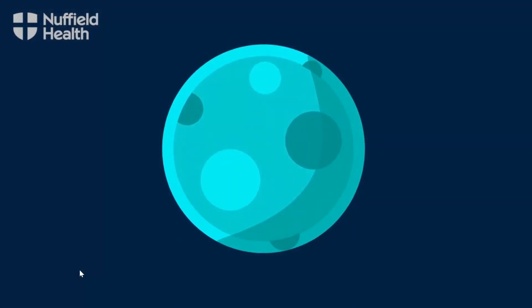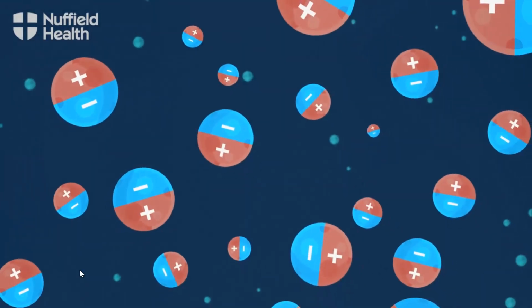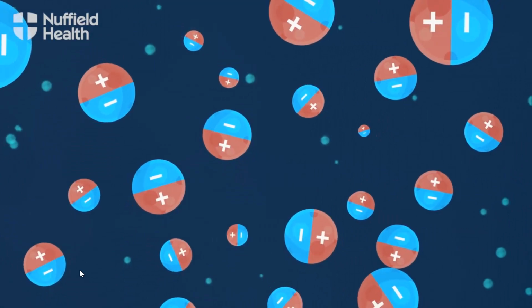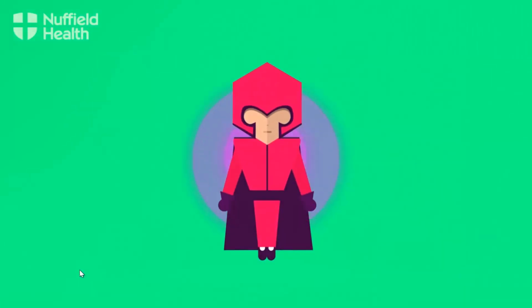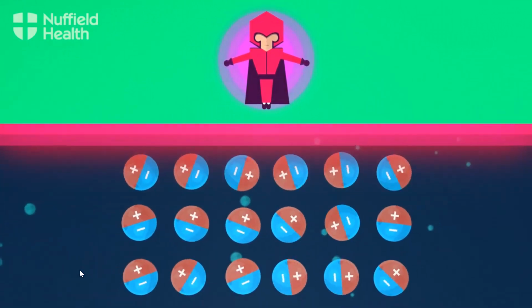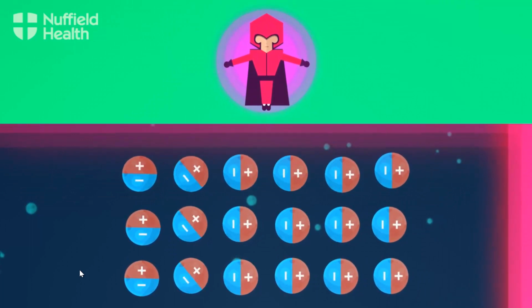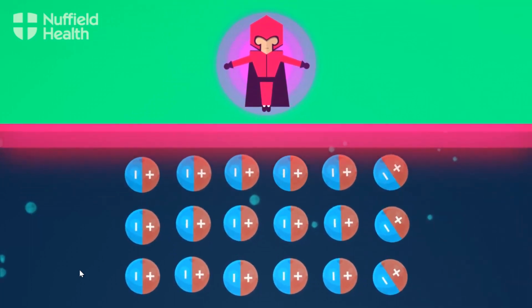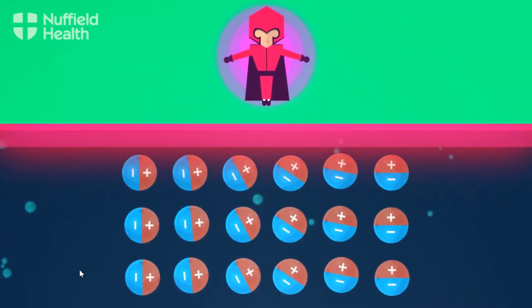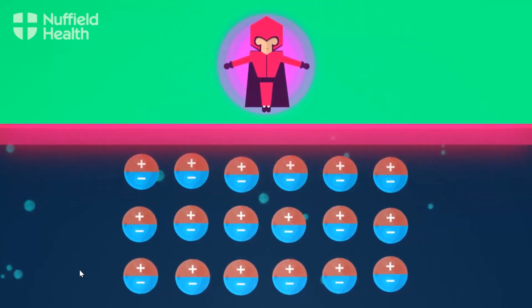This makes every water molecule in your body a tiny magnet, and there are billions and billions of them. When exposed to a large magnetic field, the molecules line up and spin at a particular frequency. A secondary magnetic field turns the molecules to face new directions, and when it's switched off, the molecules begin to realign. As they do, the frequency changes, and that's what allows the MRI scanner to peek inside your body.